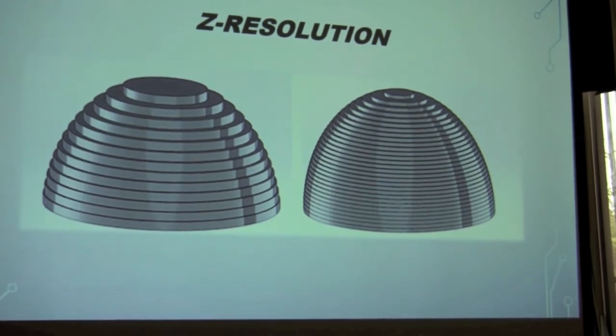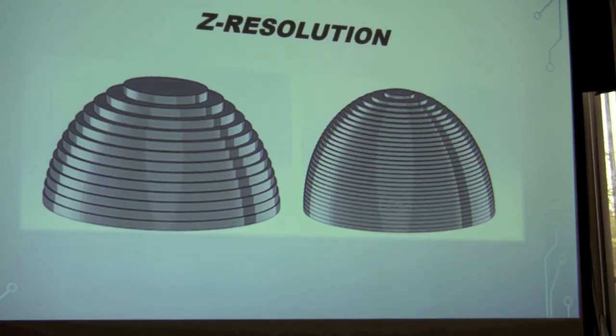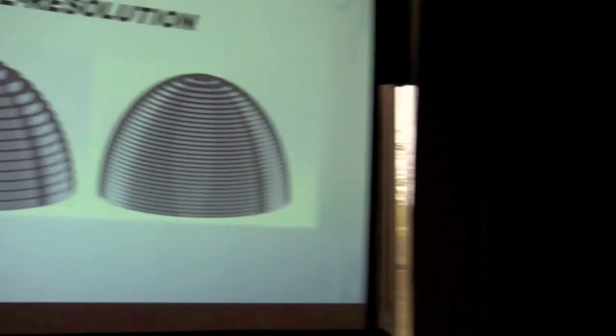Whenever you're looking at 3D printers, make sure that you see the difference between the XY resolution and the Z resolution. Acceptable Z resolution for models or demo models, or even just about anything, is 50 micron layers. If you can't buy a printer that can do a 50 micron layer height, don't get it. For XY precision, I would stick to anything 75 or lower for XY accuracy.